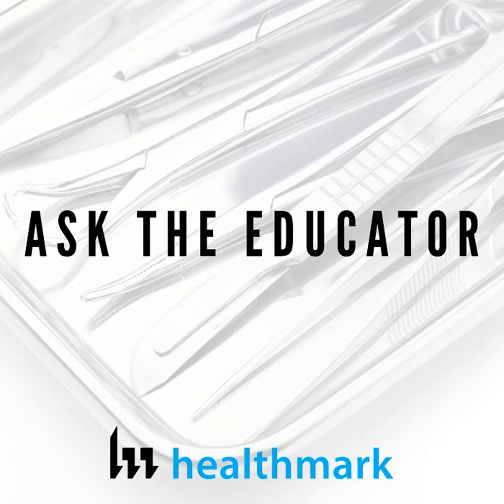Because of its great utility, its ease, and its lack of invasiveness, it's been adopted in many different areas of medical practice. When ultrasound was introduced in a clinical setting, these two came together, where ultrasound guided needle procedures greatly improved medical outcomes. Before, it was kind of hunt and poke. There were good things and bad things associated, but with needle guidance, it's very, very precise. In good hands with a good eye, you can do some amazing things. So percutaneous procedures are that group of procedures where it's ultrasound guided and you have a needle.